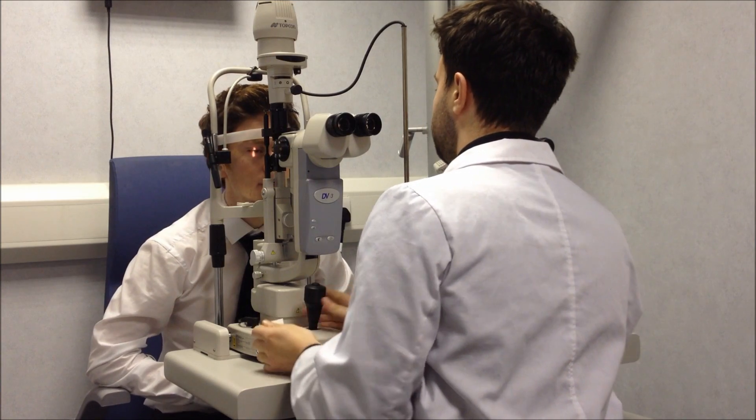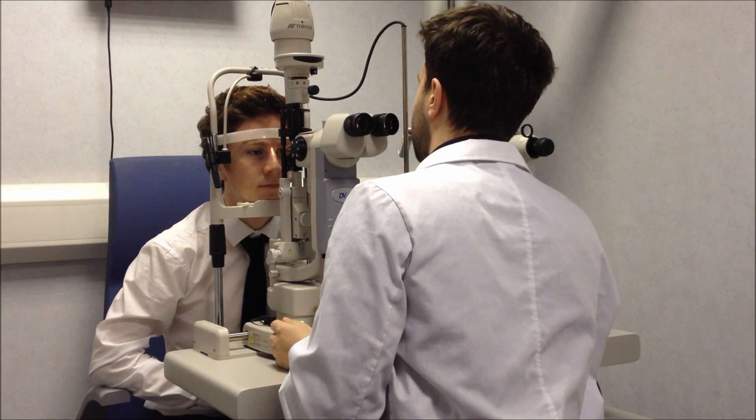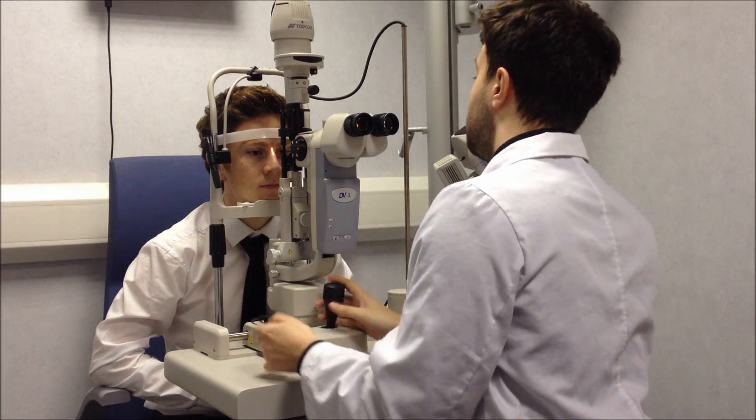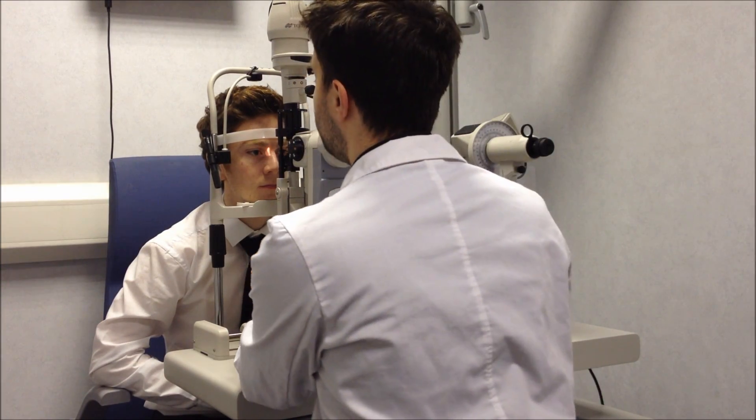I'll get you just to put your chin on the rest. Now you want to just make sure that the outer canthus is also lined up with the marker here. So once your slit lamp's set up, we'll just have a look inside.